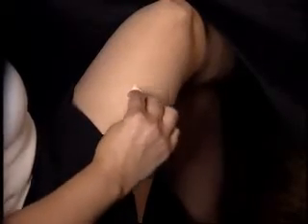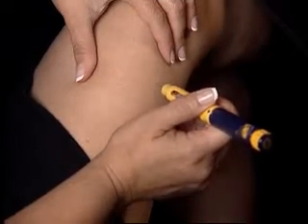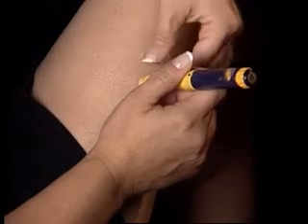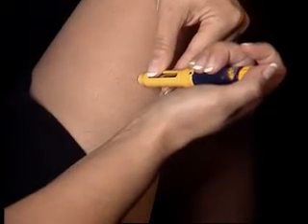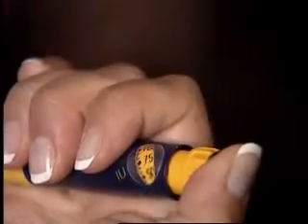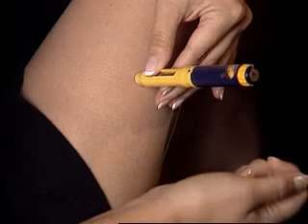Cleanse the site with an alcohol wipe and allow to dry. Hold the pen and with a dart-like motion, insert the needle into the skin. Steady the pen with your other hand and inject the contents by pushing down on the injection button at the top of the pen.